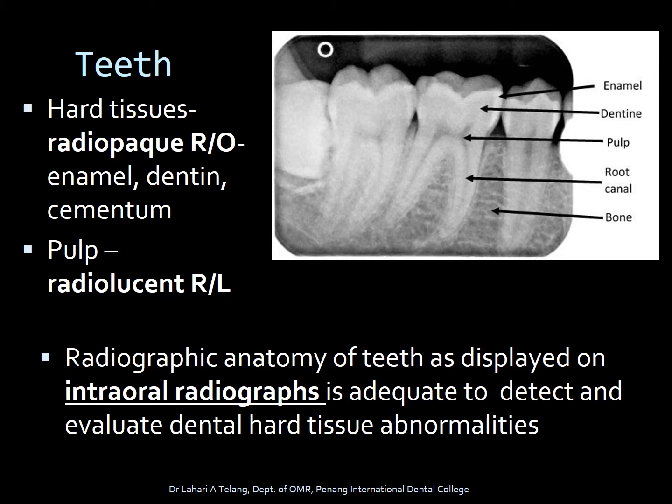The radiographic anatomy of teeth as displayed on intraoral radiographs is adequate to detect and evaluate dental hard tissue abnormalities. For the simplest forms of abnormalities like dental caries, the intraoral radiograph is more than enough to distinguish whether the patient has caries or not.